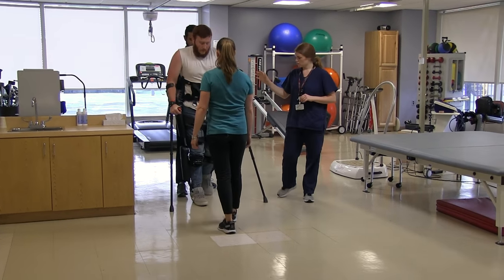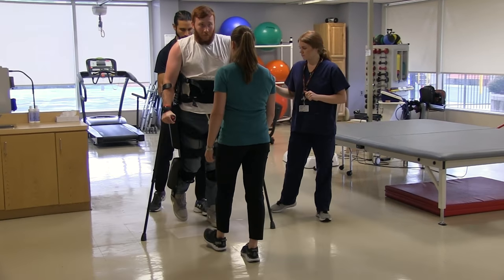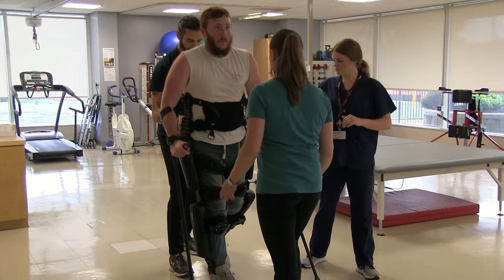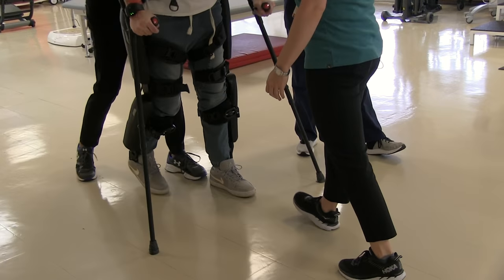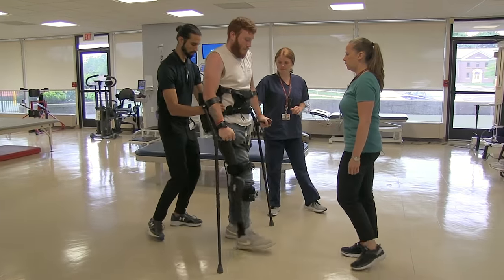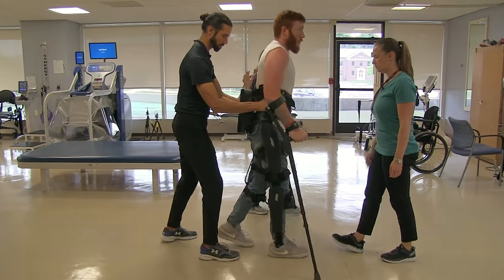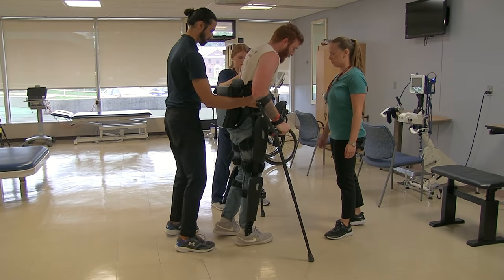Look up, keep your chest up. You're going to shift forward with the hips leading. Better — look up. You decide when to stop. Keith counts down: one, two, three. Very nice.